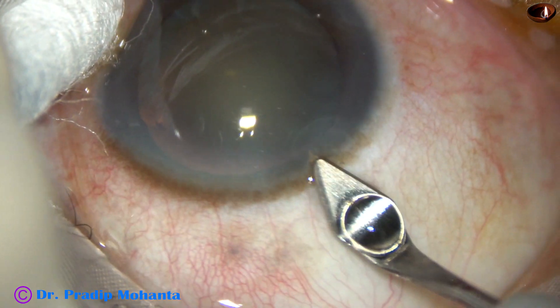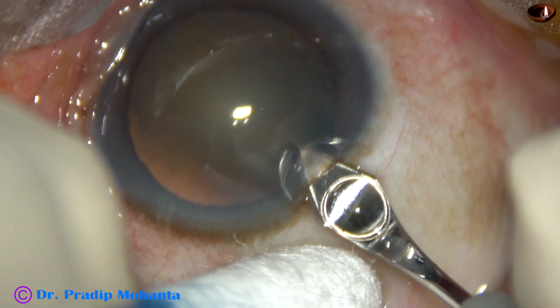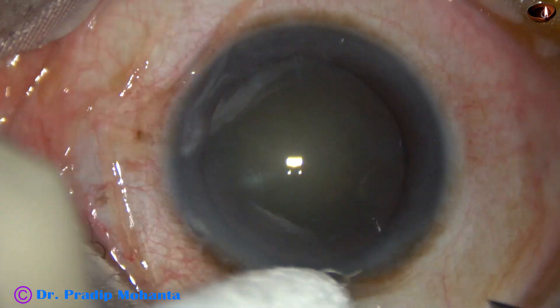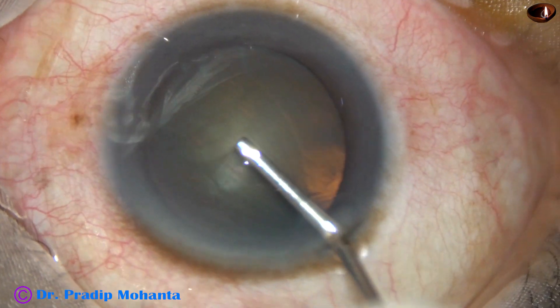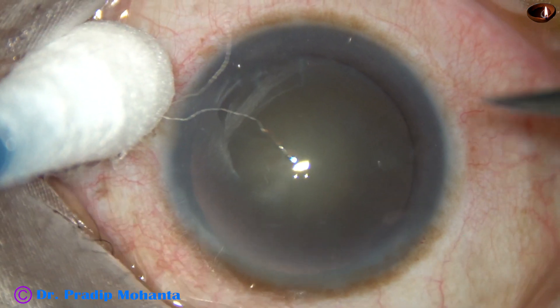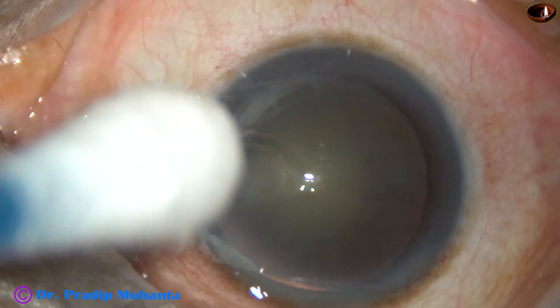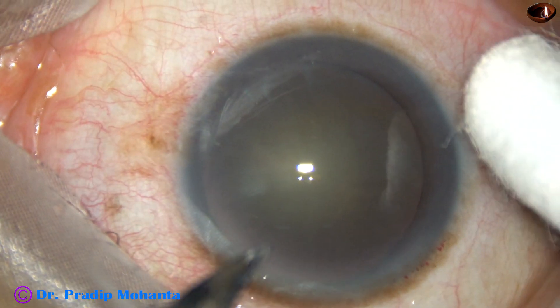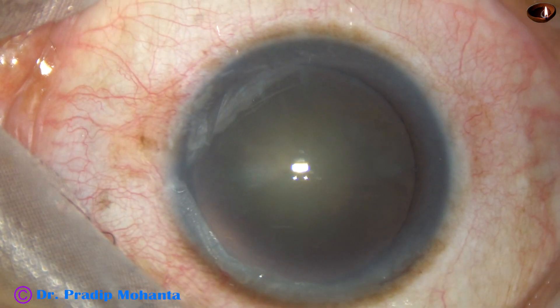This is the main incision on the posterior aspect of the limbus with a 2.8 mm keratome. Now, 2% hydroxypropyl methyl cellulose is injected into the anterior chamber. Here, one side port is made on the right side of the main incision and another side port is made on the left side of the main incision.